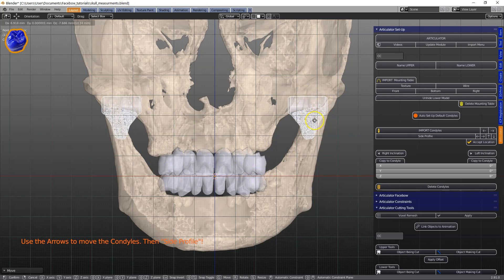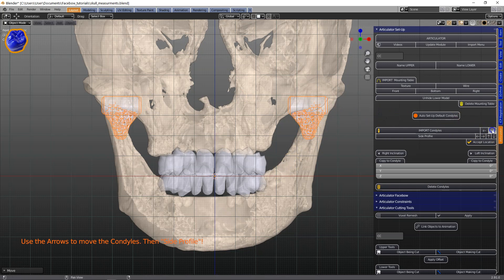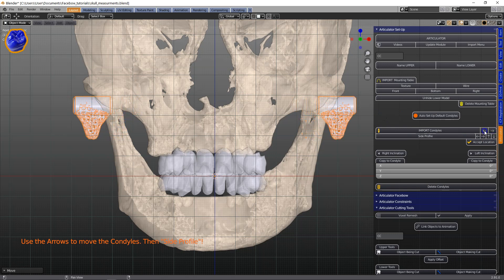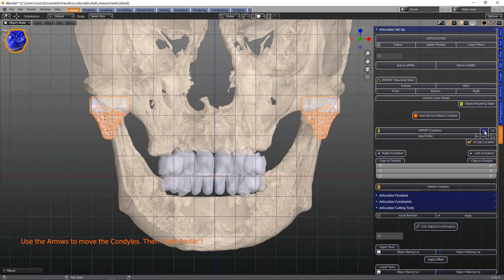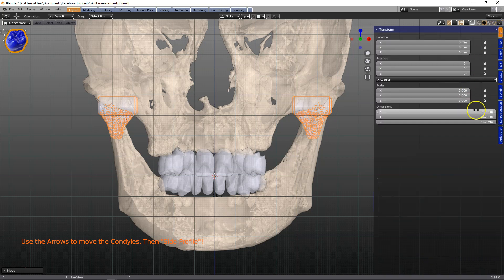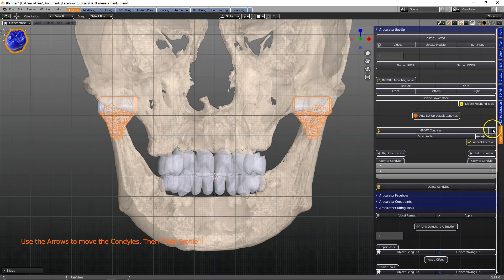We've made a few arrows on the menu where we control these. Clicking outwards and inwards will move the condyles. In the items menu you can see exactly how far apart these condyles actually are.